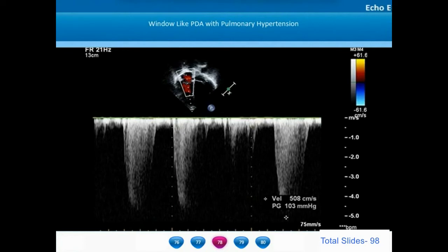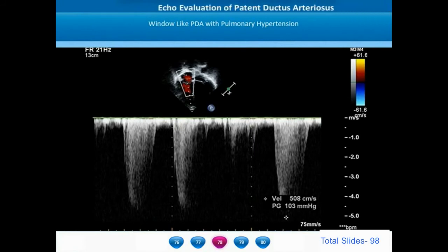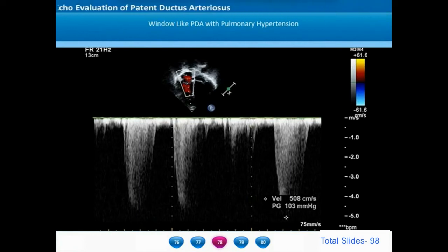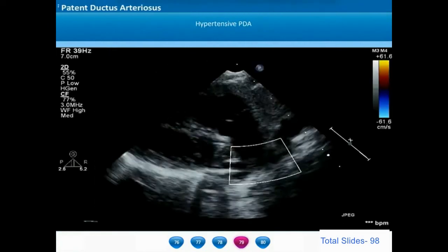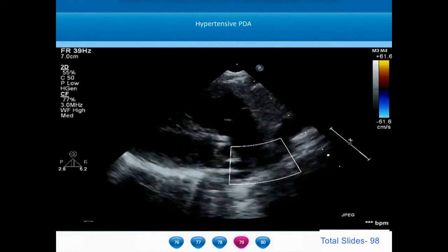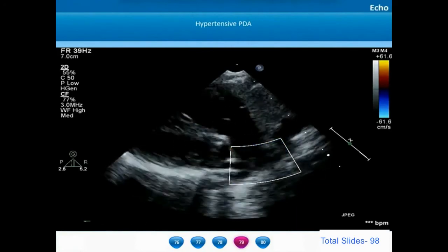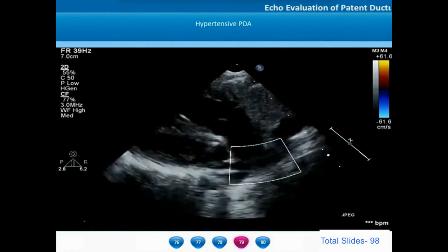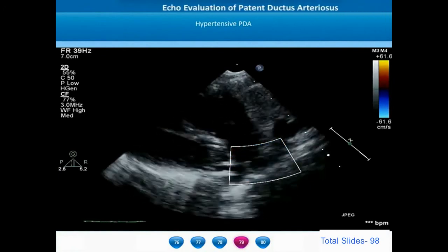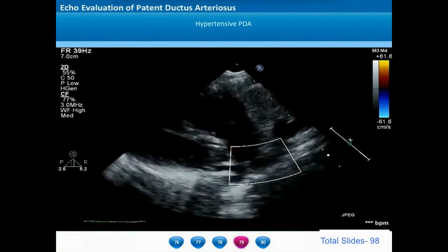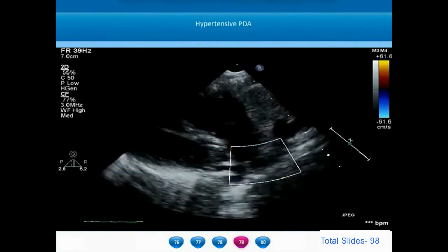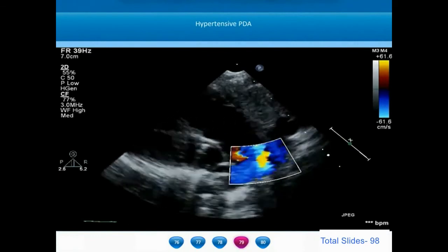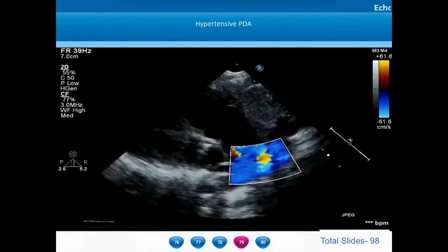Window-like ducts are difficult to image on echocardiography and are most likely to be missed. Many of these patients may be followed for years as idiopathic pulmonary arterial hypertension. In the last example, we also demonstrated features of elevated pulmonary vascular resistance: absence of left atrial and left ventricular dilatation, laminar low velocity flows from the aorta into the pulmonary artery, and lack of turbulence in the main pulmonary artery due to similar pressures in the aorta and pulmonary artery.